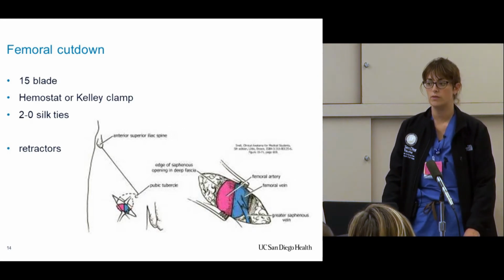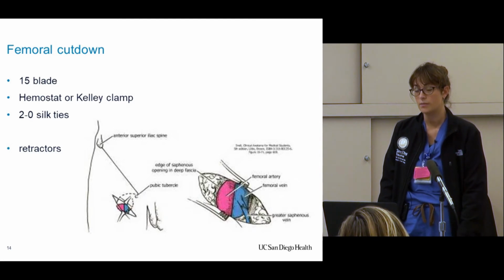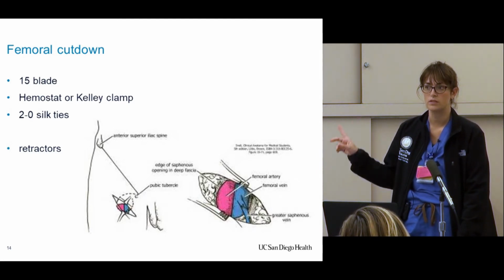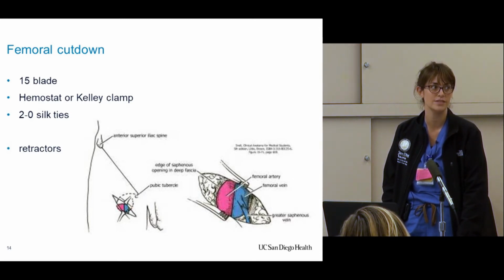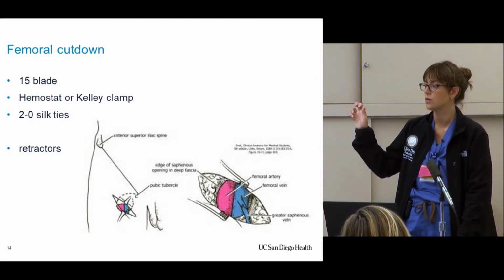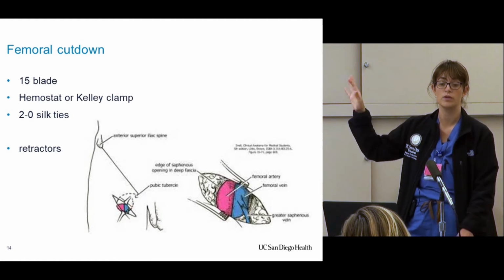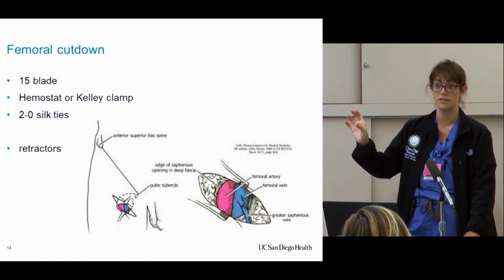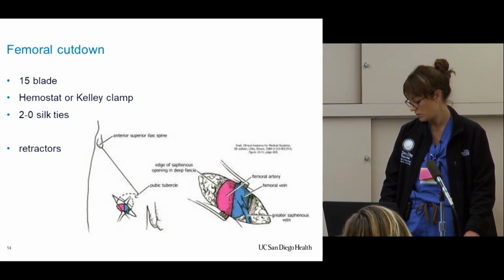The other thing too, in the REBOA setting, the patient's pressure is going to be profoundly low, right? So they may not be bleeding briskly from the surface. If there's some other indication for this and their pressure is decent, you may need some suction here because this may be a bloody mess. So having a pack of 4x4s and some suction nearby, and maybe a little thing of saline so they can splash it to see what they're really trying to look at, may be helpful.